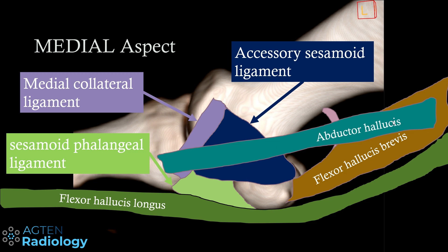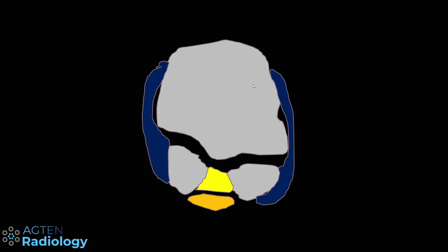Overlying on the medial aspect is the abductor hallucis tendon. The sesamoid phalangeal ligament runs from the distal pole of the sesamoid down to the plantar base of the proximal phalanx — a very important structure, sometimes also called the metatarsal sesamoid ligament.